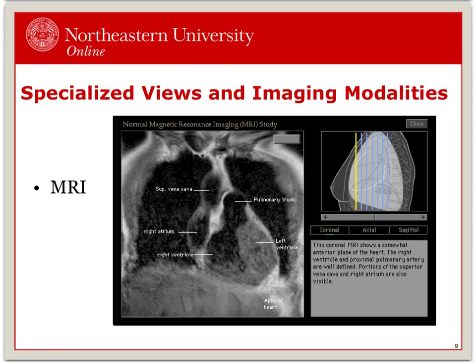Here we have an example of a normal coronal MRI image, and on the right you see the location of the scout film to help you identify your location. There are more cardiac MRIs done recently due to improved technology. It is also less expensive and less invasive than a cardiac catheterization. MRI can be more specific to identify non-occlusive coronary disease that would normally be missed on cardiac catheterization.